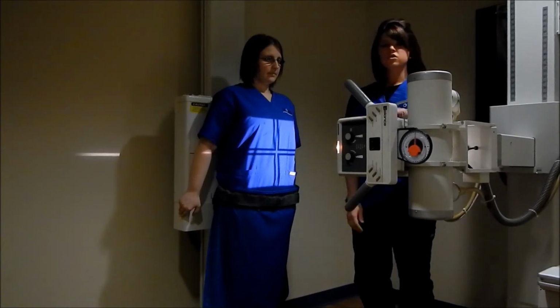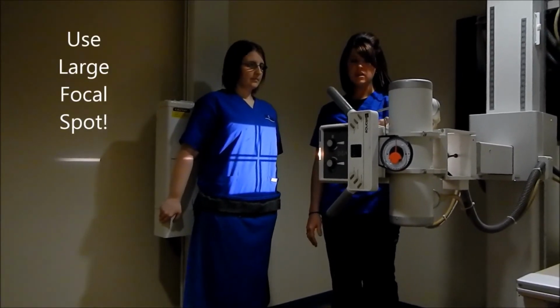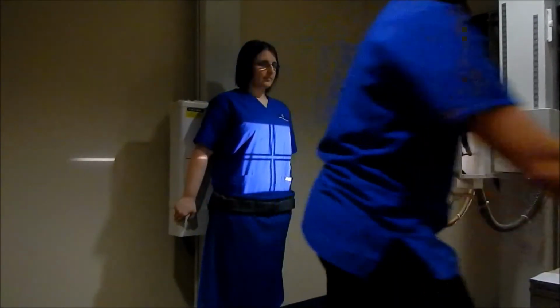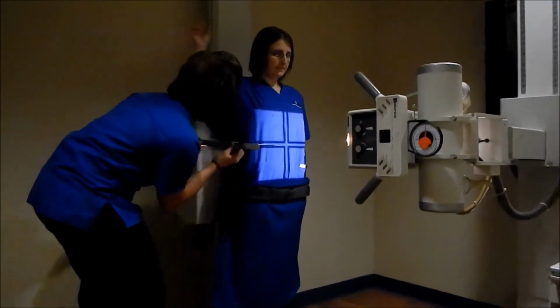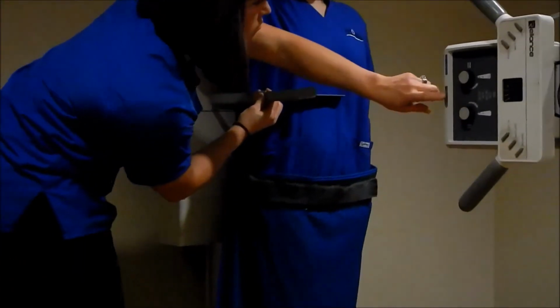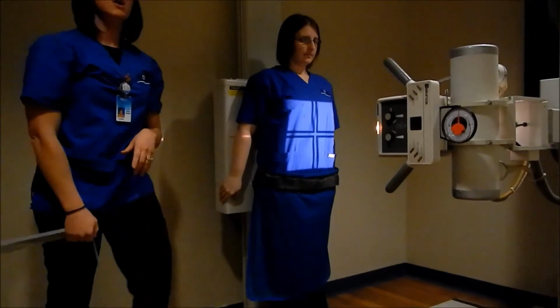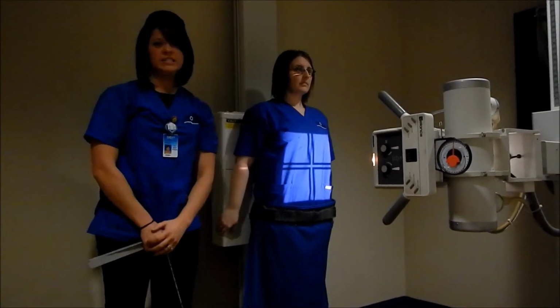You're going to want to again do this exposure on suspended expiration. I'm going to need to measure her real quick. And again, she measures 21. So I'm going to go out, set the exposures, and you're going to use all 3 AEC chambers.